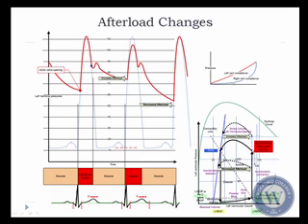If you see an acute increase in afterload, you would see that the stroke volume becomes depressed. So this is a situation where you see an increased afterload point. You can see that in increased afterload, the actual diastolic pressure point rises. But the downside is that it limits your stroke volume, so your actual peak wave drops. Sometimes you'll see a drop in systolic pressure as you increase the diastolic pressure, so you get a lessening of your pulse pressure height.